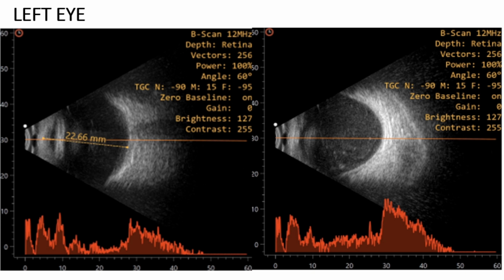The left side scan shows the ONH shadow. So what is the inference? Or you can put it in differentials. Vitritis. So either post-op inflammation or infection. It has to be one of the two.